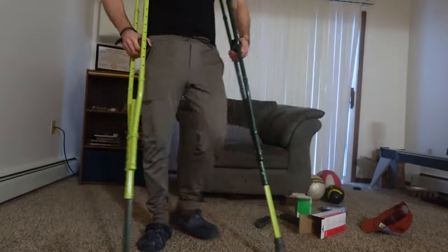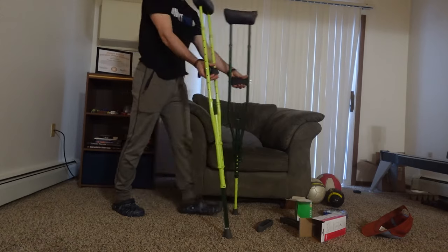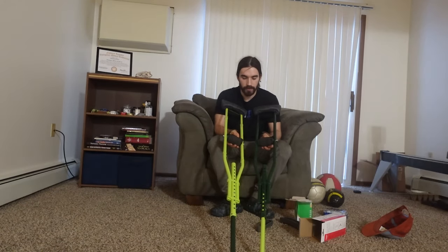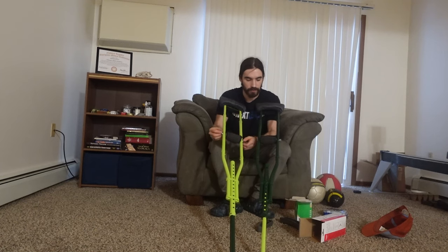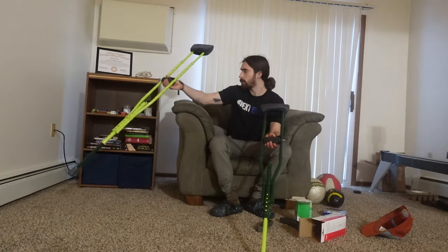The foam is on the crutches and you can already tell that there's a big difference in comfort. There's a little bit of foam on the top so I need some water, but it's looking lively.